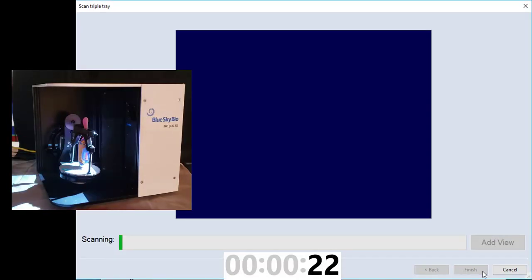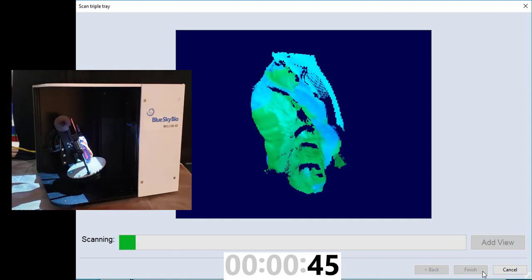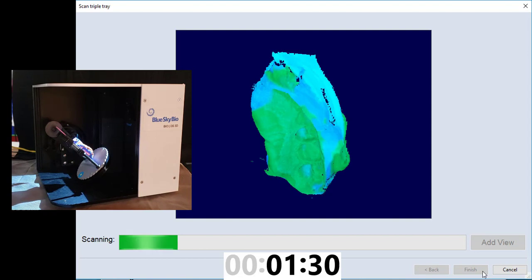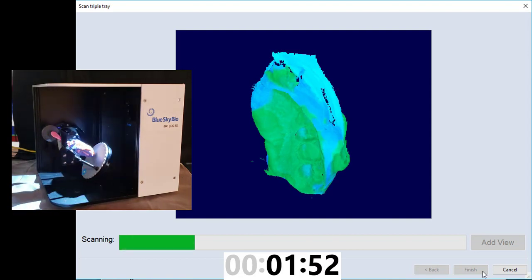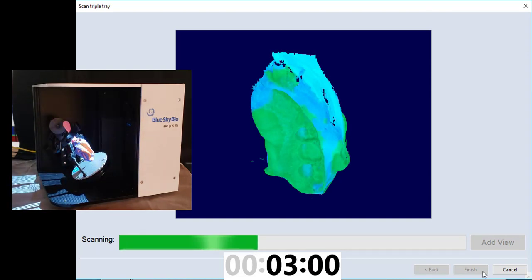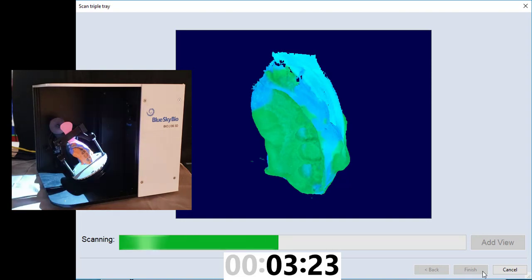And as we scan, the software is going to take multiple views of this impression as it scans it. This does take the longest of all the different scanning options because we're trying to generate the most accurate mesh possible. We're getting repeatability tests down around 11 microns. So it's highly accurate, and the goal with this is to be very hands-off.